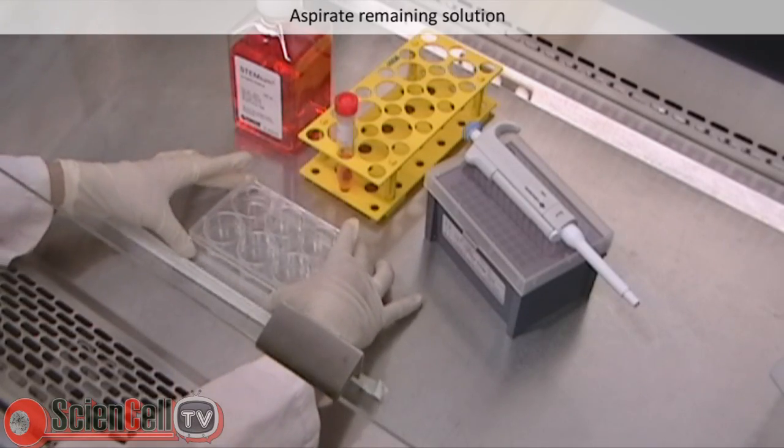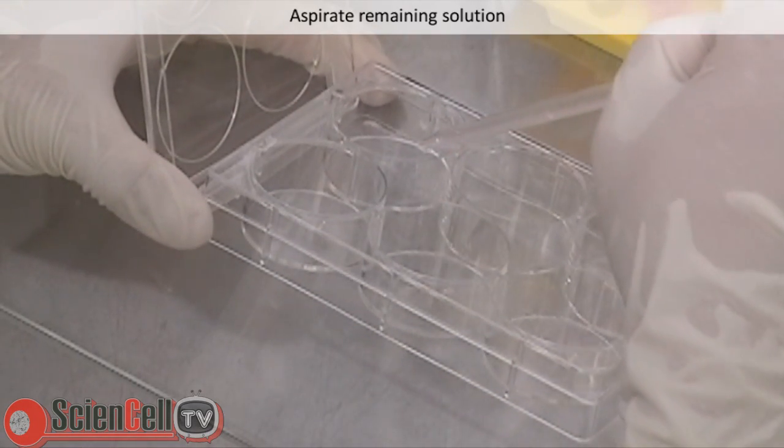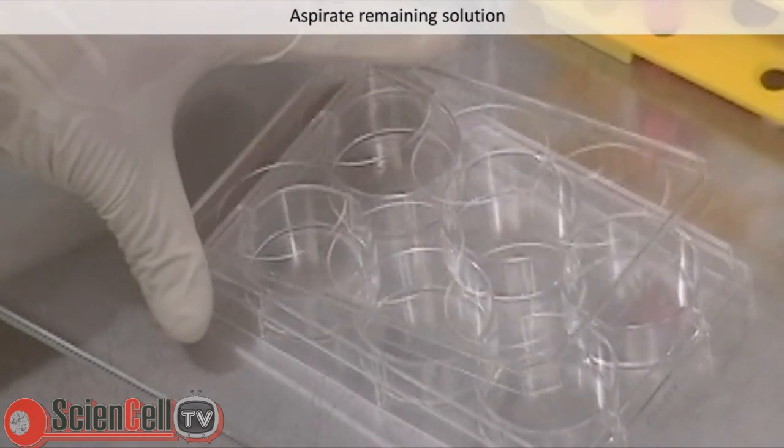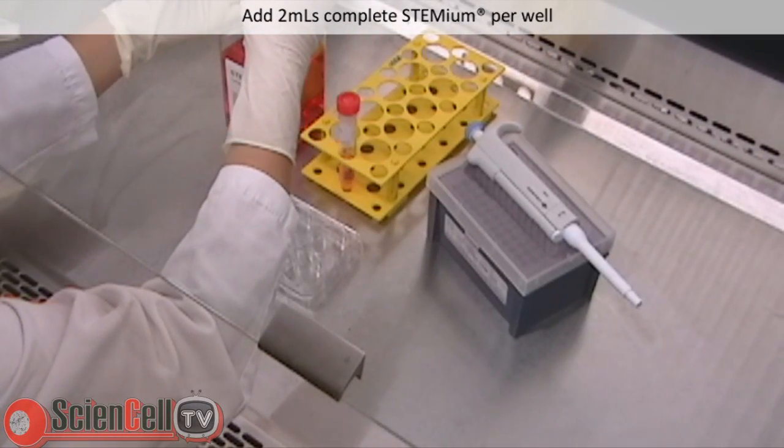After incubation, remove the BD Matrigel coated plate and aspirate the remaining solution from the well while avoiding contact with the substrate. Next, add 2 mL of complete Stemium and the plate is ready for use.